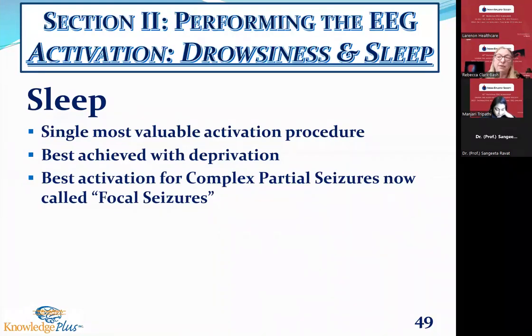Again, the hardest seizures to diagnose are what used to be called complex partial seizures, now called complex focal seizures. It's behaviors that can be very subtle and to a lay person don't look like, is that a seizure? That could be a seizure. So sleep is really critical. Now, if we don't do our job, if we don't create an environment for sleep, don't worry, they're coming back. Epilepsy doesn't go away. But if we don't catch it early, we have a smaller chance of finding effective treatment. So it's important to do our best to get all of the activation procedures performed during a study.